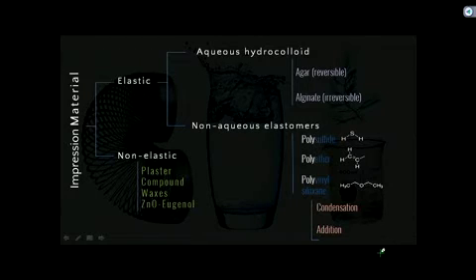The condensation you've used, I believe already, did you guys make the little putty index for your class 4 restorations? You had two wads of putty, and then you mix them together. We can use those as a template to set in the mouth, but those aren't to be used to make a final impression to make a prosthesis off of. The reason for that is over time, the condensation is not as dimensionally stable as our addition PVS. Condensation has a byproduct, which is ethanol. Addition does not.